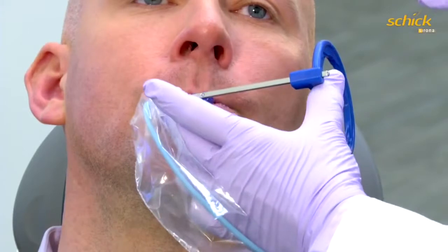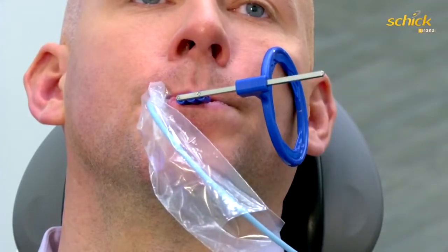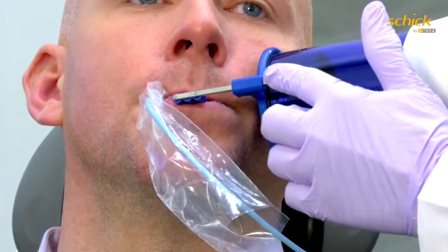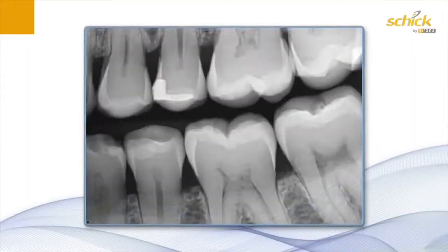And for every single image, we're going to make sure that the ring is against the patient's face and that the cone is up against the ring. And the cone and the metal arm are parallel. Now we're ready to take our shot.